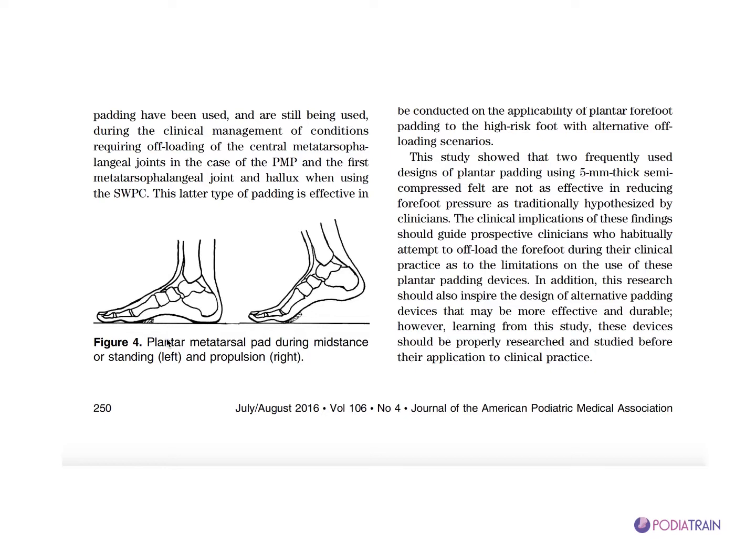Our patient is clearly not so, and so we have decided to use a UD plantar cover instead of a plantar metatarsal pad, or a PMP.